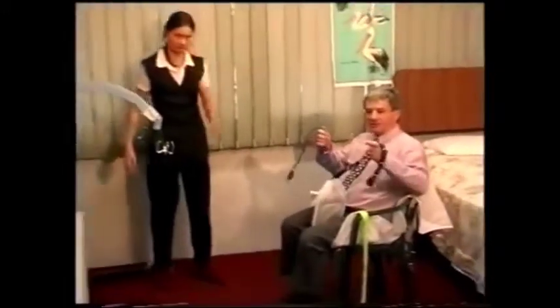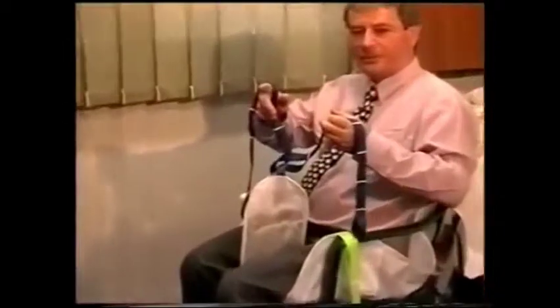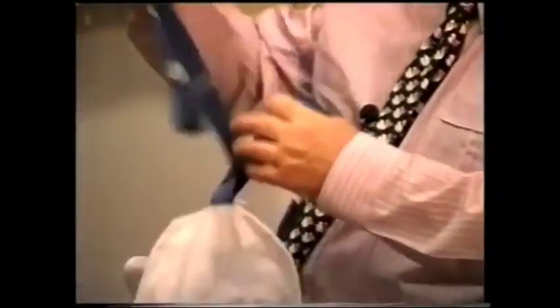Now that was having the legs put through like this. Can you just show this, James? Come in close. So we've got one, thread it through the other one. So we just thread through like that, and then they hook up. Now, showing it another way, can you bring the hoist in again?